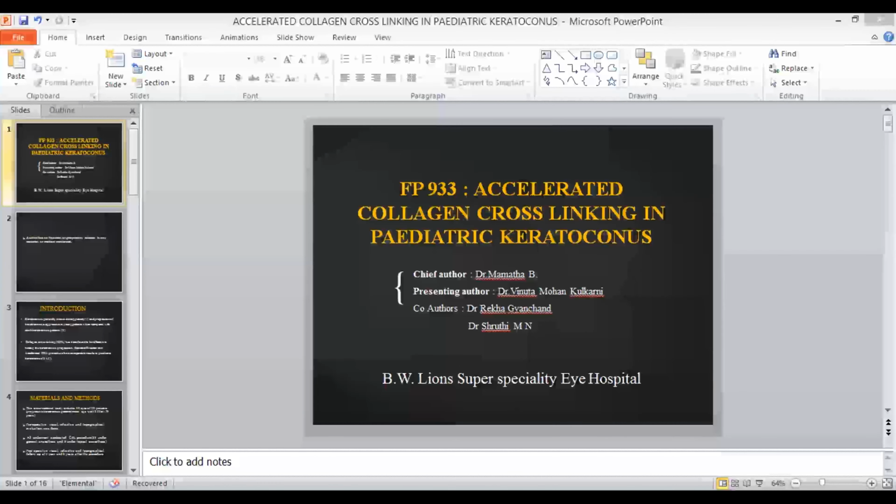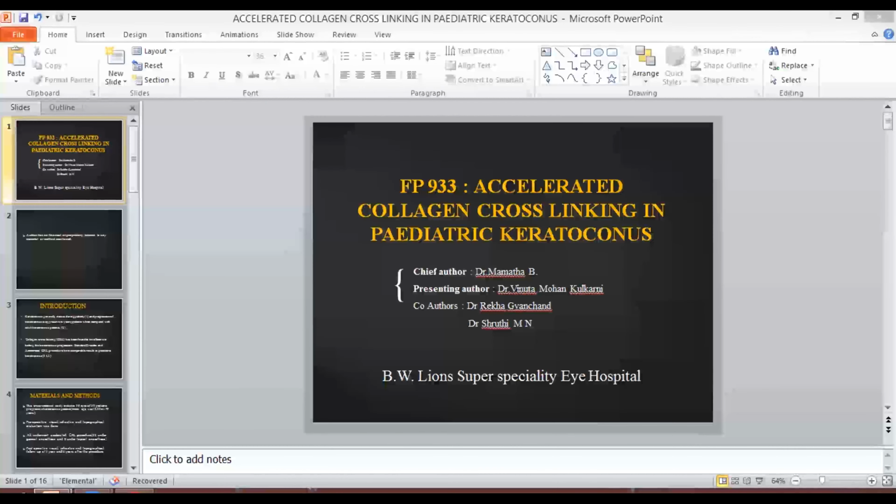So good morning, everyone. At the outset, I would like to thank COSCON for giving us this wonderful opportunity to present today. So today I'll be presenting on accelerated collagen cross-linking in pediatric keratoconus, no financial disclosures. As we all know, keratoconus generally occurs during puberty, and progression of keratoconus is aggressive in young patients when compared to adult KC patients.